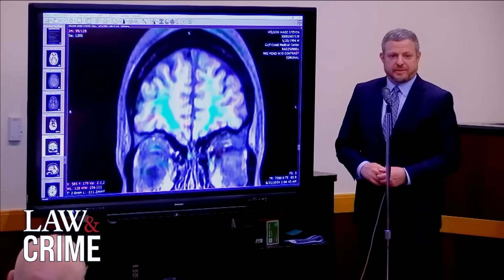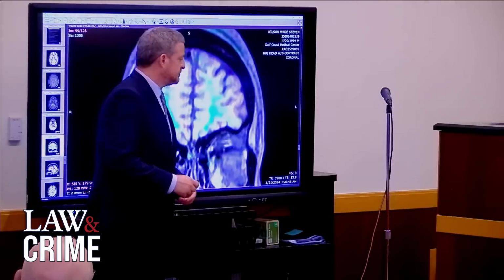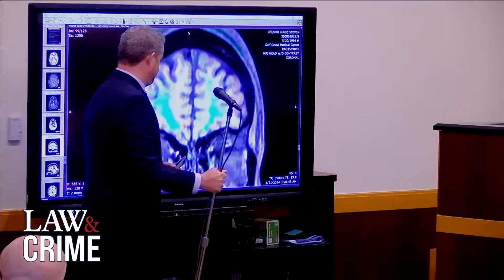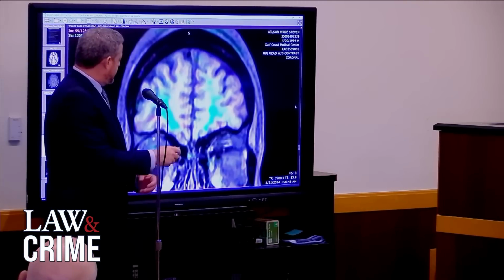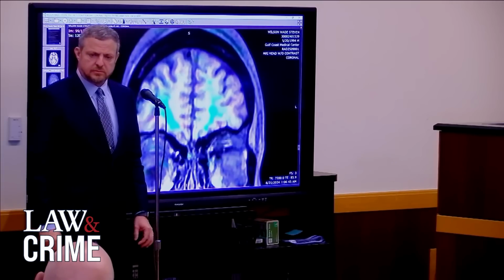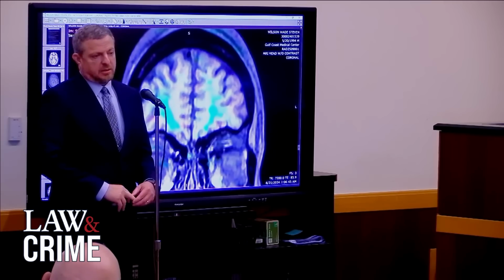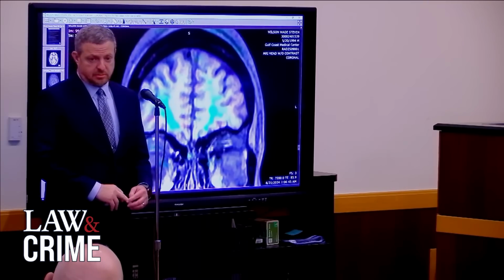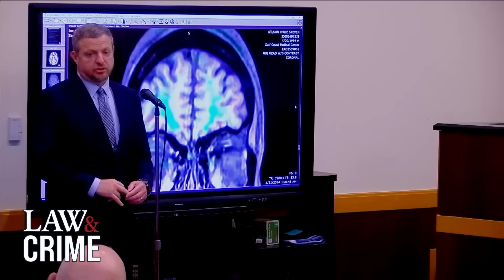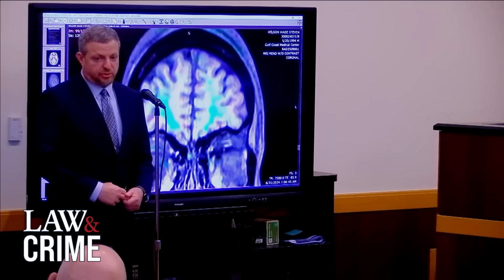Okay, this is a color picture. This is our DTI. Let me get over here so you can see better. You can move the microphone with you. Thank you. So what we're looking at here is... Let me interrupt you a second. You're using some initials here. What is DTI? DTI is diffusion tensor imaging. What's it designed to show? Axonal interruption. Theoretically from traumatic brain injury. However, white matter lesions from like strokes can cause that to be abnormal as well. But I can tell you that he has no white matter lesions on his brain.